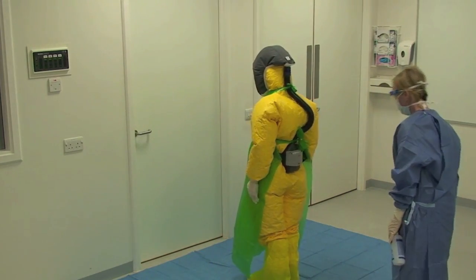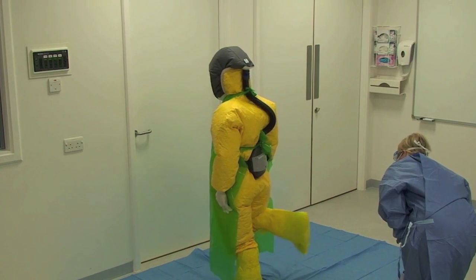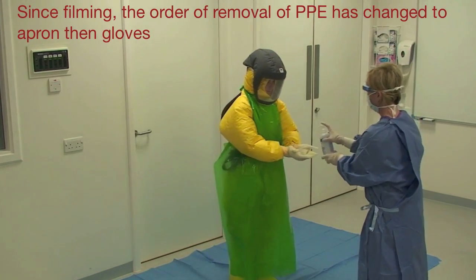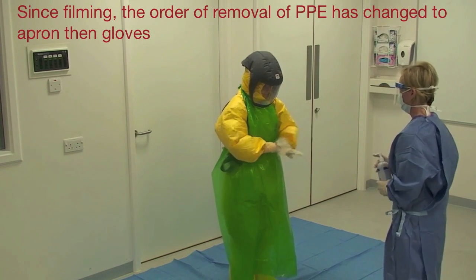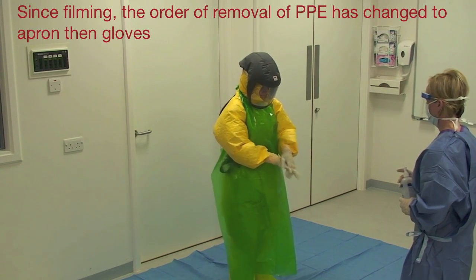The buddy inspects the healthcare worker's PPE as they leave the isolation room. Should the PPE be contaminated then the buddy should wipe with chlorine impregnated wipes at 5000 parts per million. The buddy applies alcohol based hand rub to the healthcare worker's gloved hands, and the healthcare worker rubs this into their gloves.